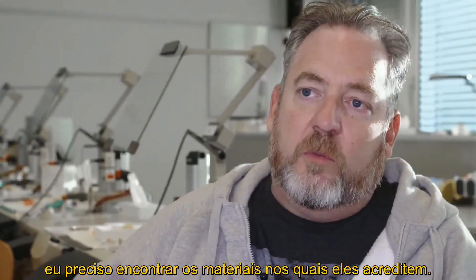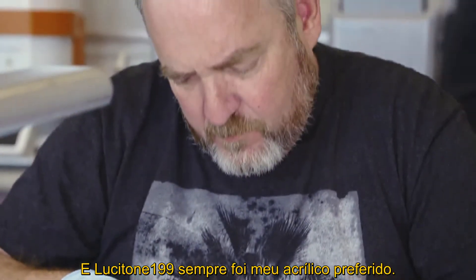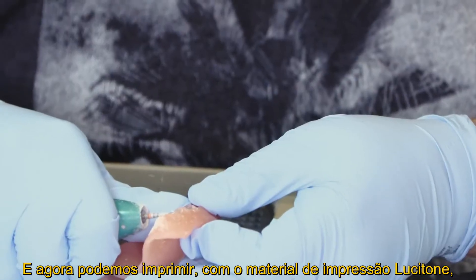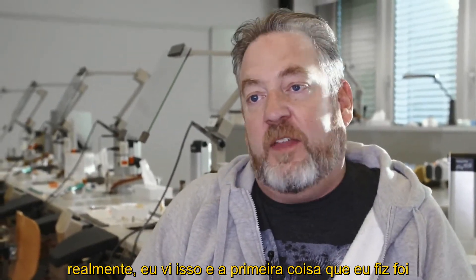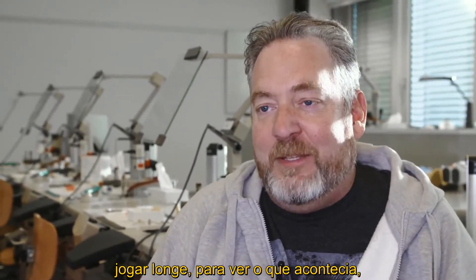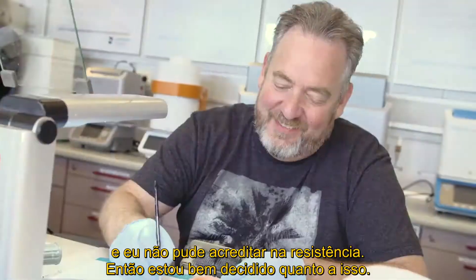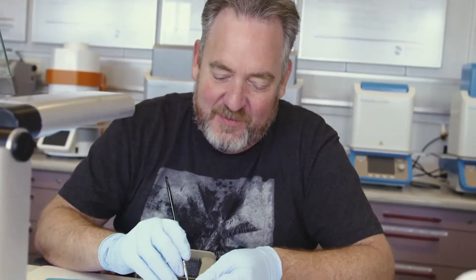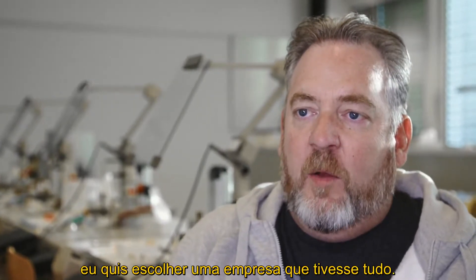If I want my doctors to believe in digital dentures, I have to find the materials they will also believe in. Lucitone 99 was always my go-to acrylic. Now that we're able to print with the Lucitone printed material, the first thing I did was throw it across the room just to see what happens — and I could not believe the strength.